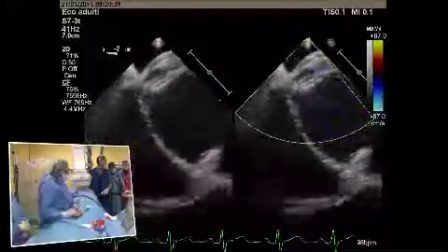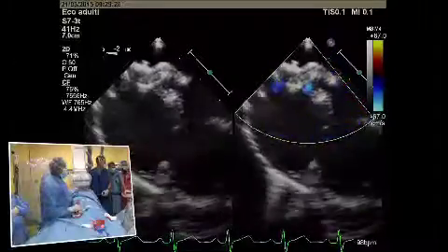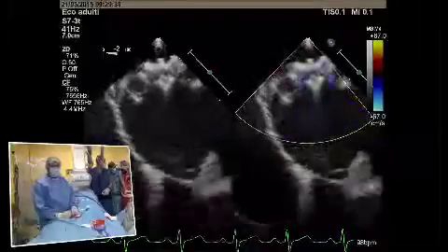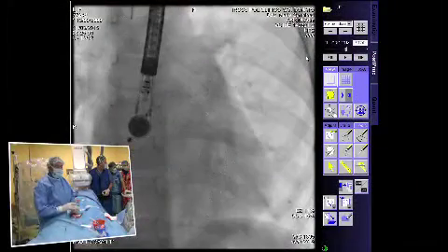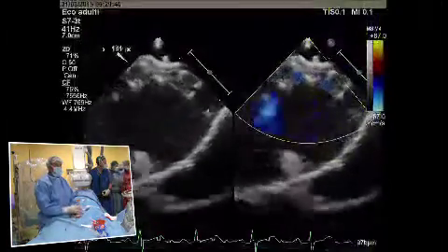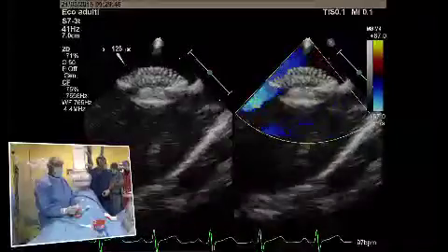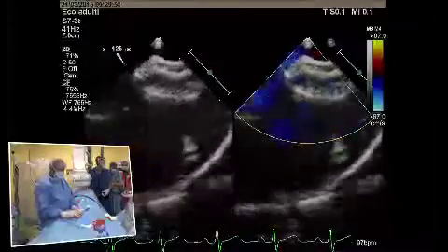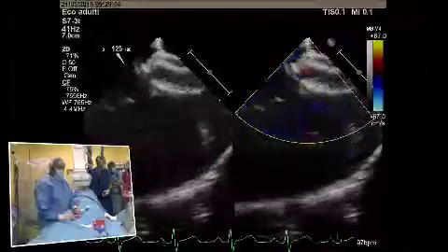Questions from the audience? Yes, Giovanni. Morning, Mario and Lucky. Actually, it's Case, and I think the right upper pulmonary vein technique is very good. You made the comment about checking that the cable is stuck to the device, and I think when you're doing that technique, it's probably important to check again if you have to repeat the procedure, because the cable can get unstuck as the device comes from the pulmonary vein into the atrium. So if you're not successful like you were first time round, you have to do it several times.